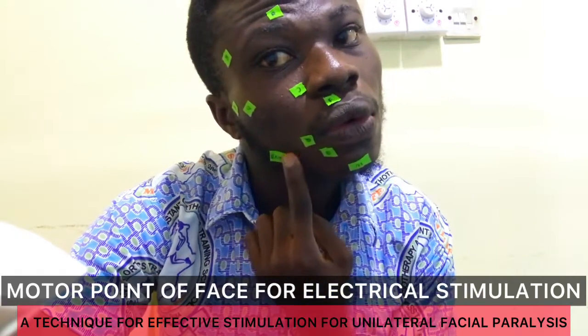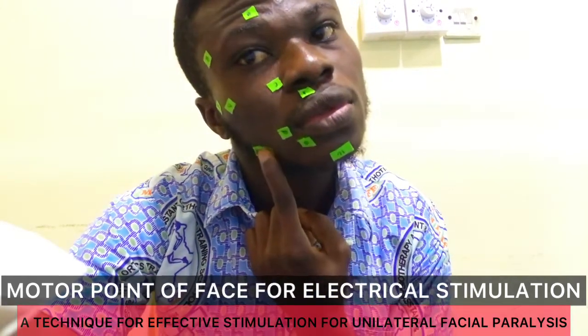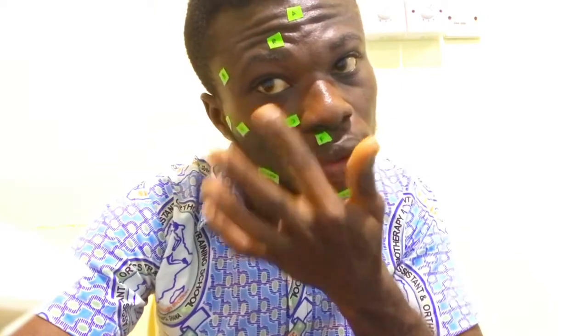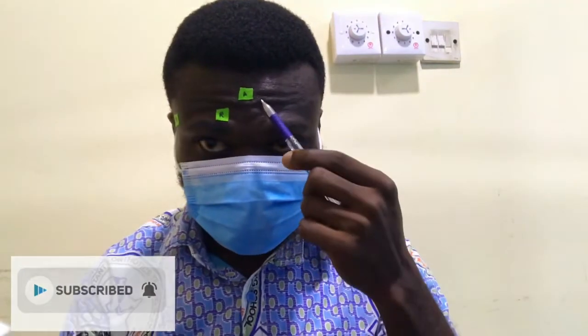But achieving the best result from your stimulation relies on correct placement of electrode pads. This has become a common problem in clinical settings, and we need to place more emphasis on it. There are sections on the face which relate to a particular muscle or muscle groups where stimulation can be done. We don't just place the pads anyhow. Any area with a pad should have a reason for which it is applied there.